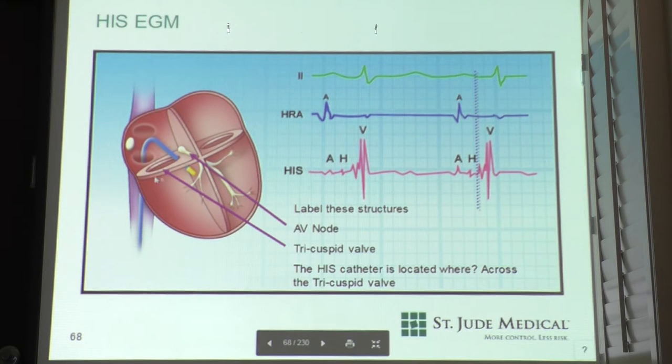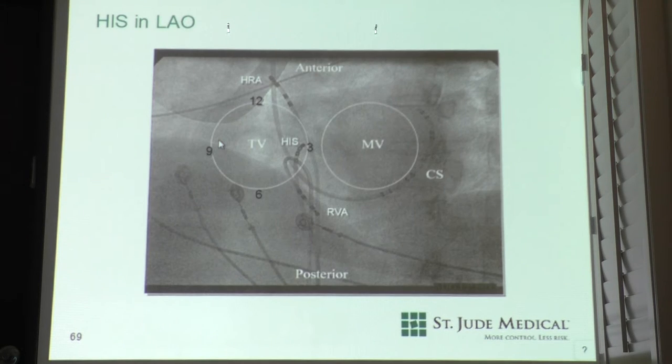They're pointing to the tricuspid valve. This is the annulus across here. So what valve would this be, separating the LA and the LV? Mitral, yeah. That part's basic, sorry. Okay, so here's what a basic study looks like on fluoro. This view is designed to provide you a shotgun barrel view down that valve plane. So you have the tricuspid valve on the left and the mitral valve on the right.